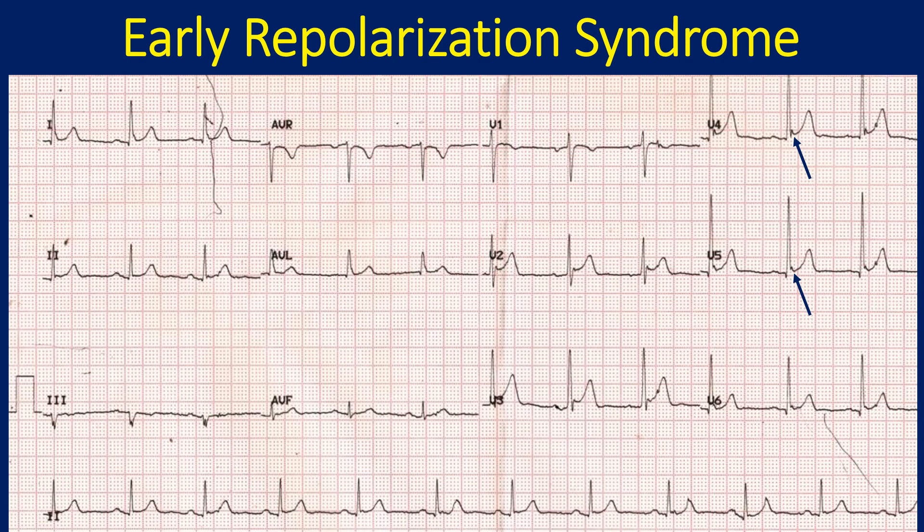ECG showing early repolarization syndrome. Concave upwards ST segment elevation with a notch at the end of the QRS complex, or a slurring of the terminal QRS seen in lateral leads, is characteristic of early repolarization syndrome. This one apparently belongs to Type 1 described above.